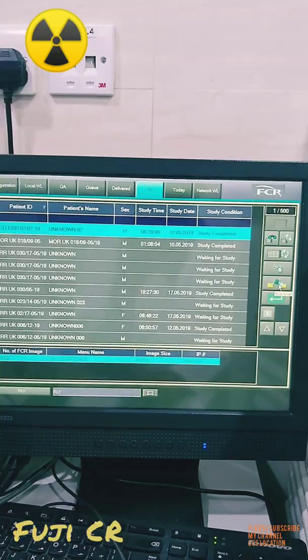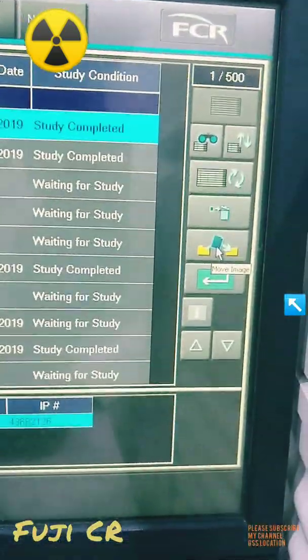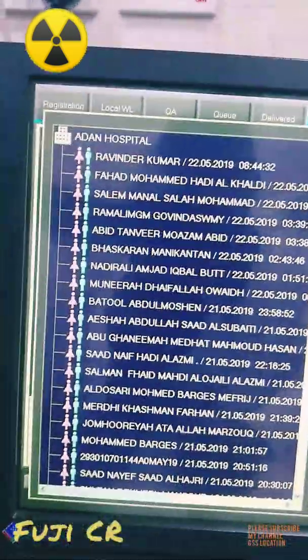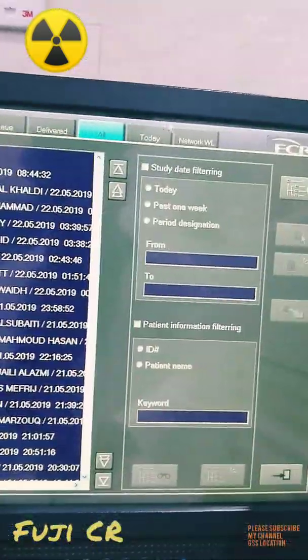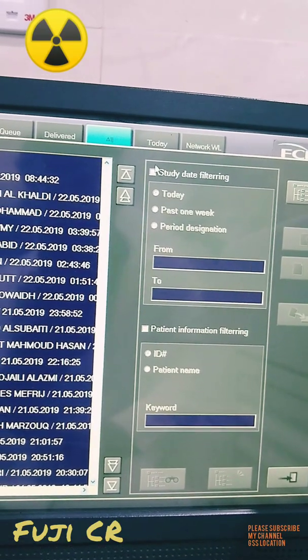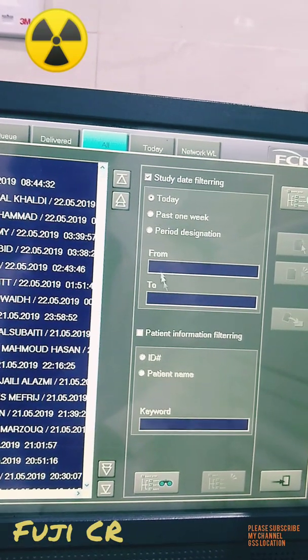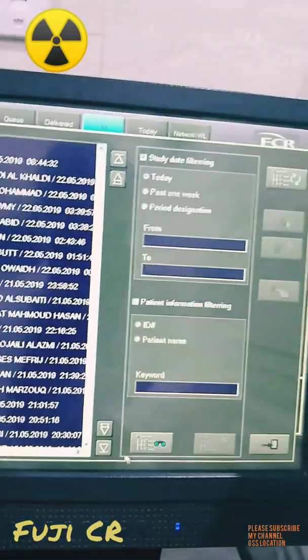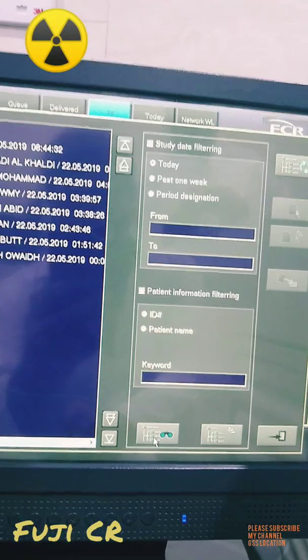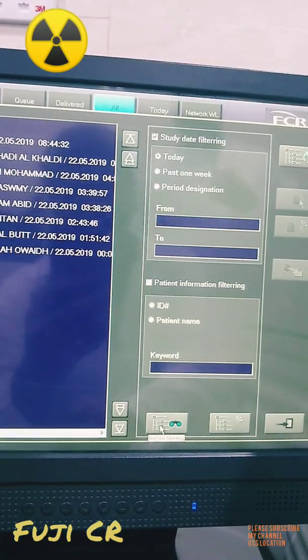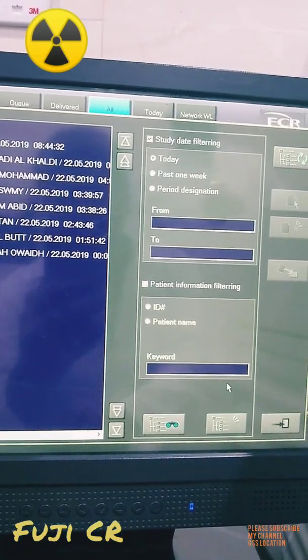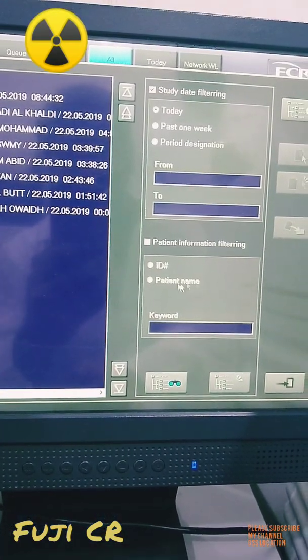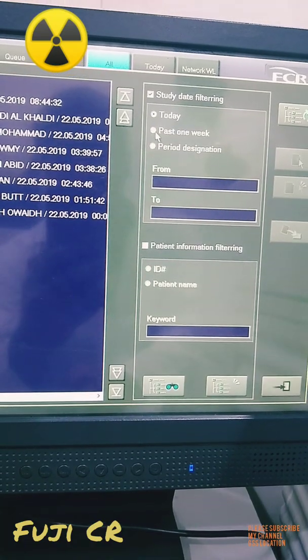Go to 'All Cases.' In this view, go to the option called 'Move Image.' Once you click 'Move Image,' you will get the patient data list. You can see filtering options — such as today, one week, or a custom date range — and you can search by patient ID or patient name.